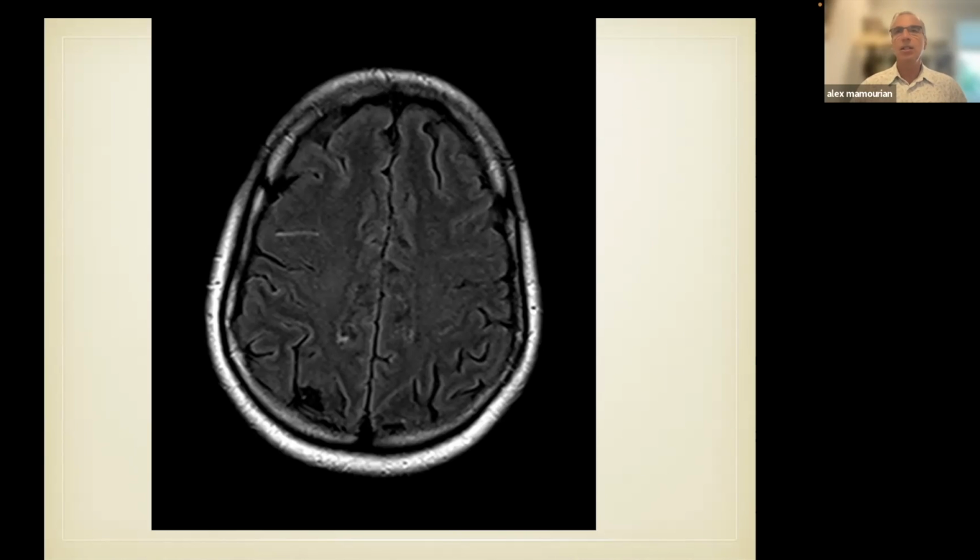So my sense is at that point, you still need to do a spinal tap to see if there's evidence of blood. But if I had a patient in that scenario with a negative CTA and a negative CT scan, I think that the chances of that patient having a ruptured aneurysm is extremely small, maybe less than 1%.